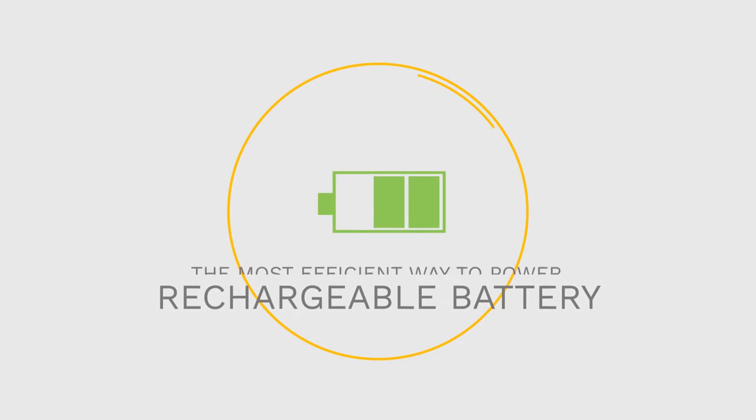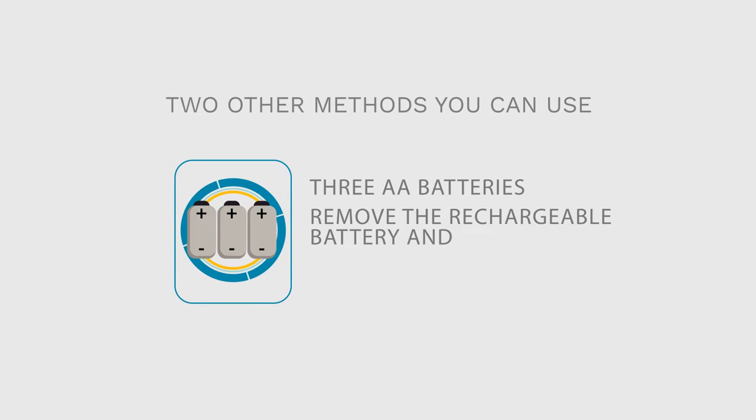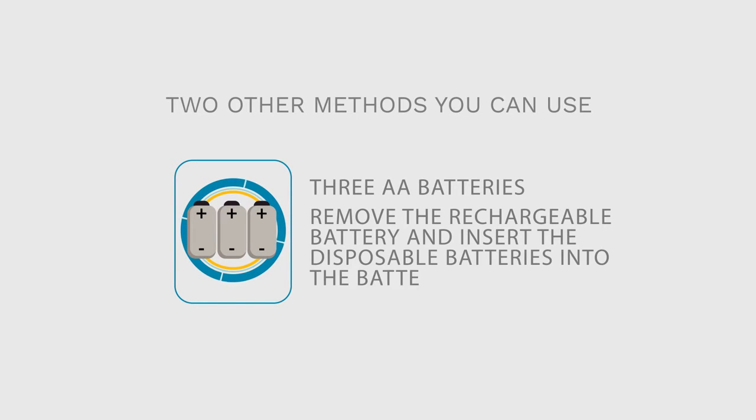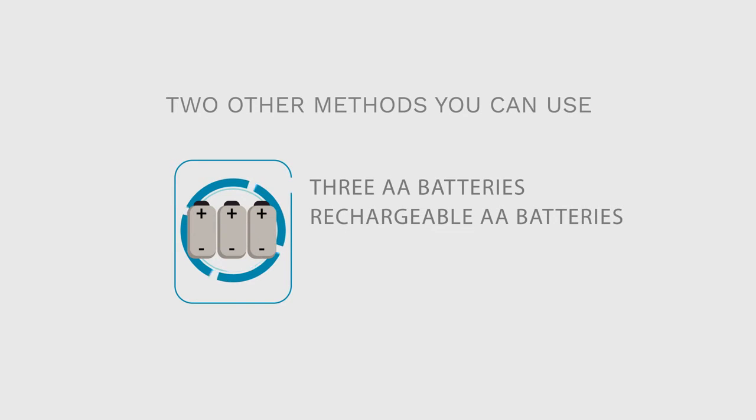The rechargeable battery is the most efficient way to power your oximeter, but if you have an emergency, don't forget that there are 2 other methods you can use. 3 normal alkaline size AA batteries. Remove the rechargeable battery and insert the disposable batteries into the battery case. Just make sure that the plus and minus points are facing the right direction. You can use rechargeable AA batteries in the same way.